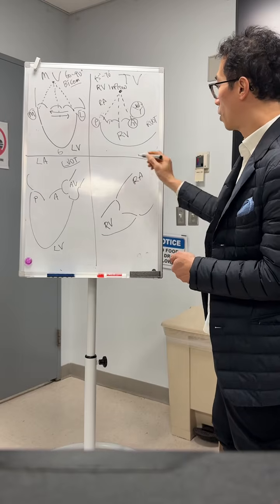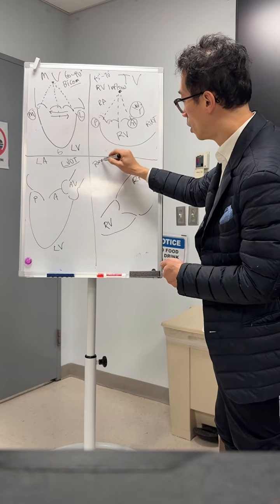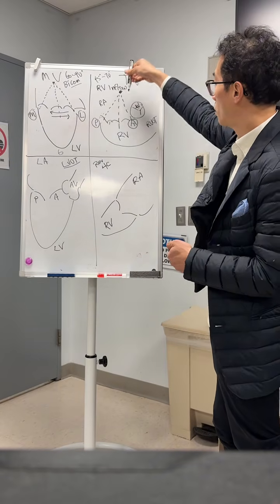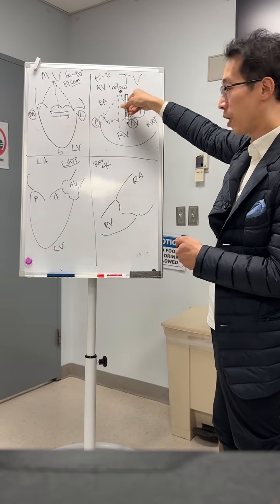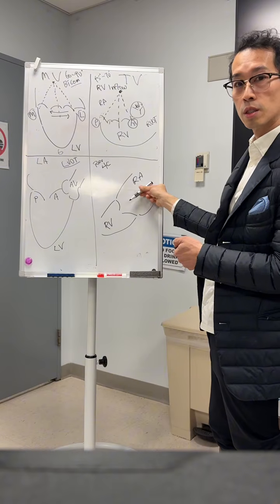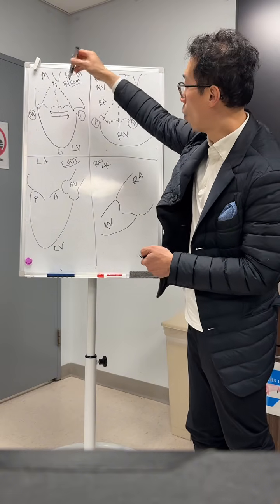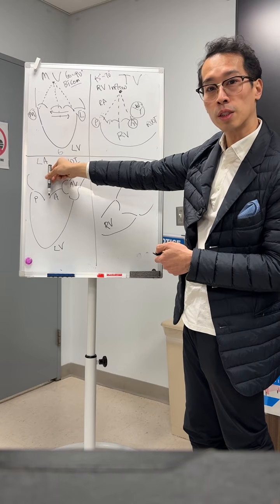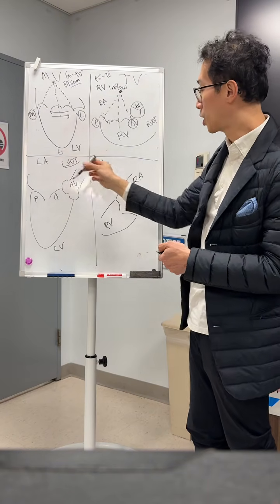So this is going to be your kind of what we call a reverse 4-chamber view, right? Okay, so your device, whatever target you're beaming, will look like this. Okay, in the mitral side, once you're steering above the valve, you could be looking like this. Okay, so it's a similar principle.